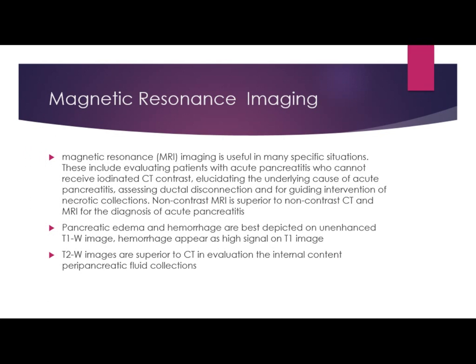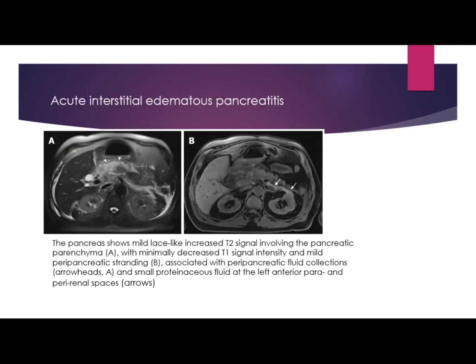Okay, MRI is beneficial. Non-contrast MRI is superior to non-contrast CT, especially in a patient where we cannot use iodine contrast media. Pancreatic edema and hemorrhage are best seen on T1 and T2 for the internal content of peripancreatic fluid collection.